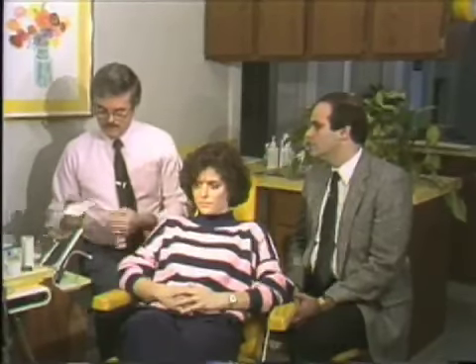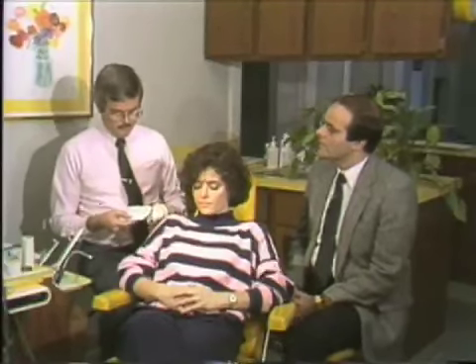I think we first would like to deal with the question of whether or not the brackets, as they are provided by the manufacturer, actually do contour the teeth. And we have already checked these brackets, the brackets as you can see here, so that we know that they do fit the contour of the patient's teeth. This is critical, especially if you're going to use a no-mix adhesive.